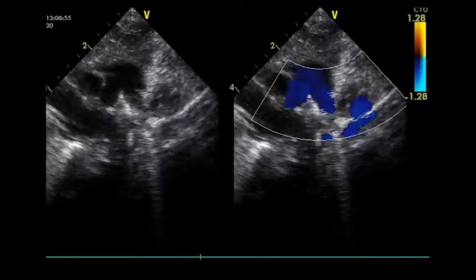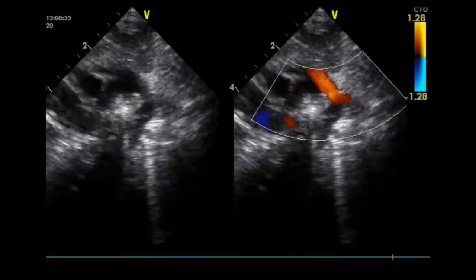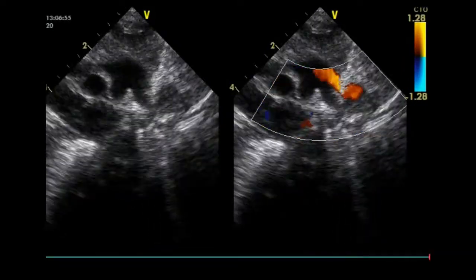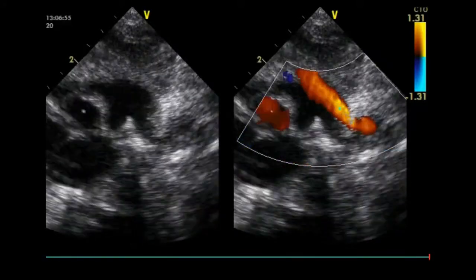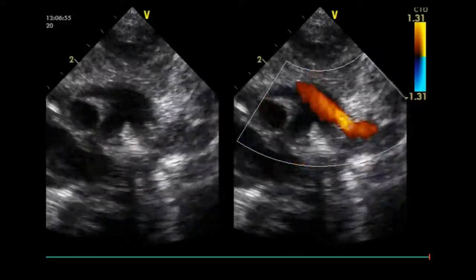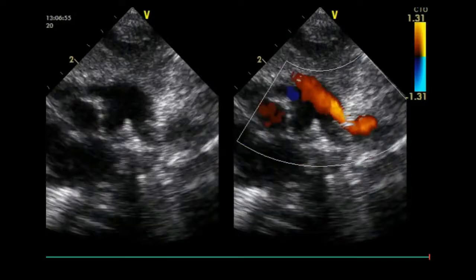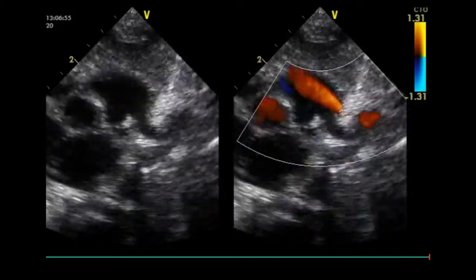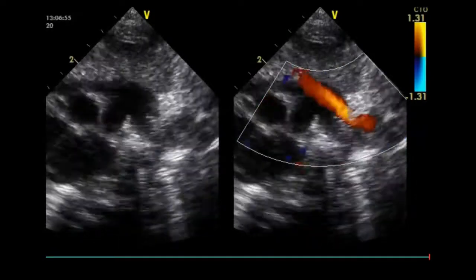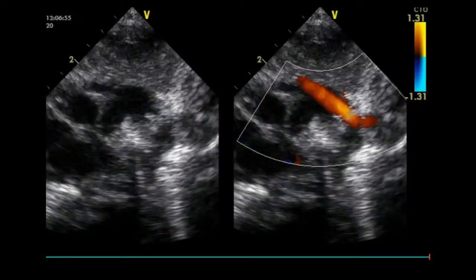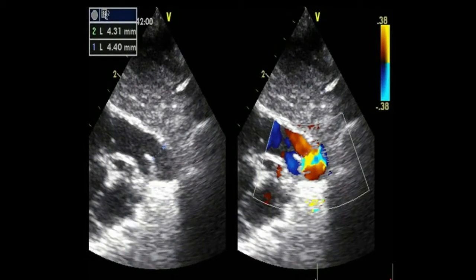The most accurate view for measuring the size of the DA is the high left parasternal short axis window, also called the ductal view, concentrating on the main pulmonary artery. The origin of the right pulmonary artery, which is not always visible, and of the left pulmonary artery can be visualized; the DA is positioned to the left of it. The DA should be measured at its narrowest point, before its entry into the main pulmonary artery.